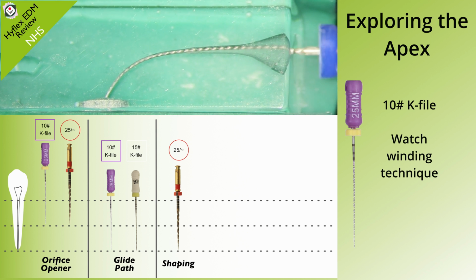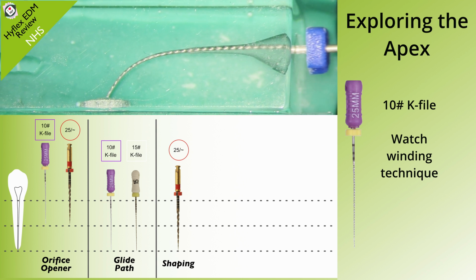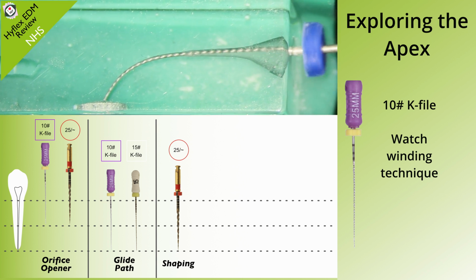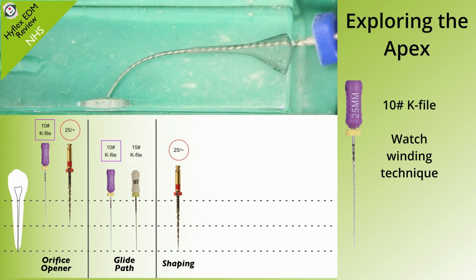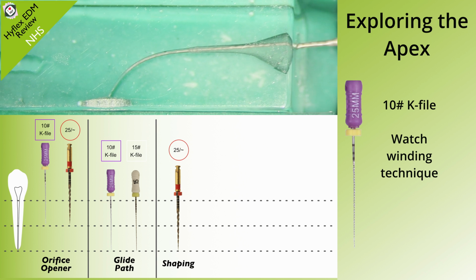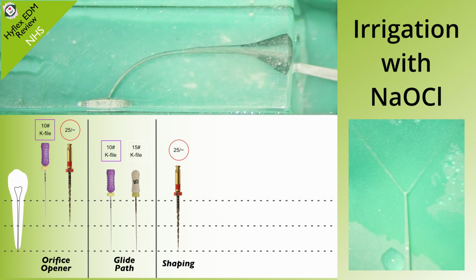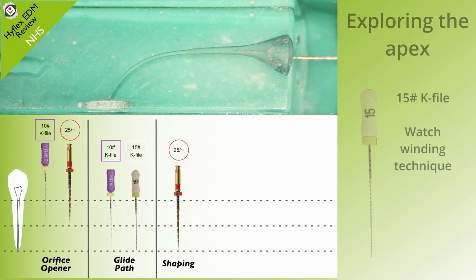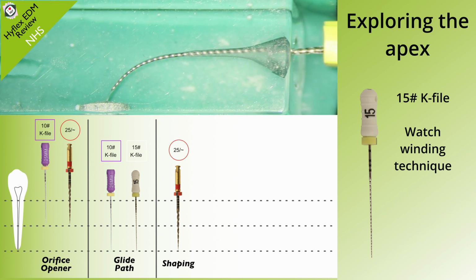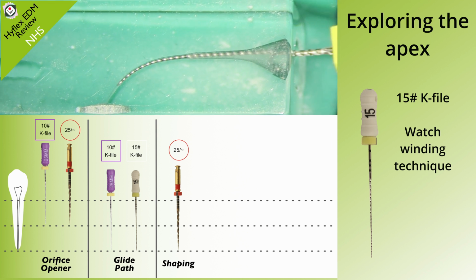And now, once I've opened up the orifice, I'm going to explore the apex with the size 10K file using the watch winding technique. Really opening up that canal space with the size 10. More irrigation, get all that debris out. And now I'm going to explore the apex with a size 15K file. Now, it's important to note that it's sometimes quite difficult to go from a size 10 to a size 15 because it's a 50% jump in diameter.